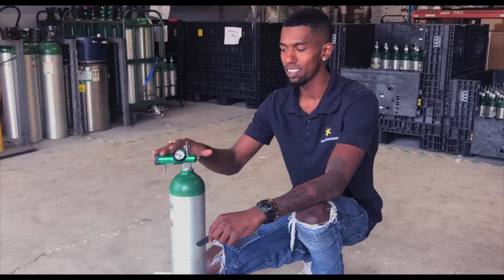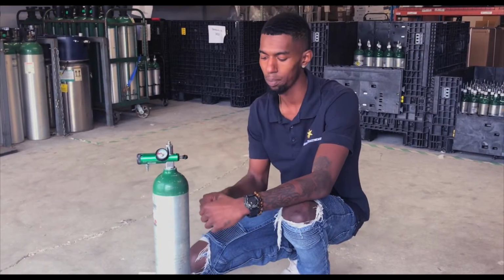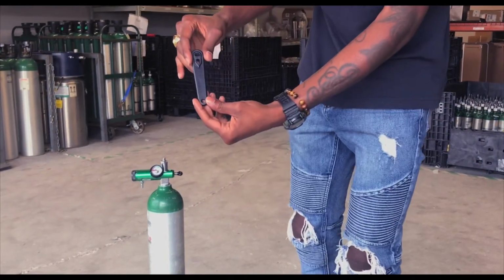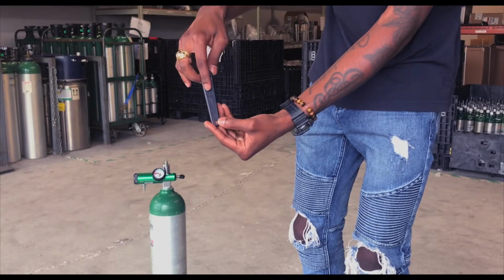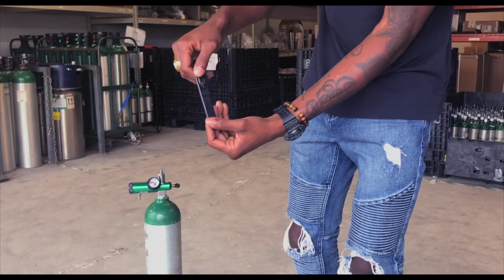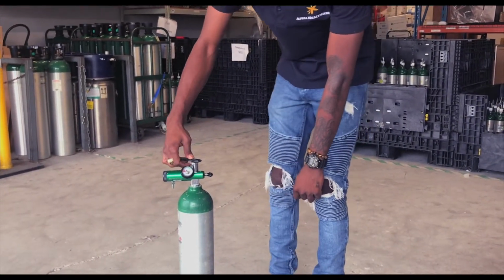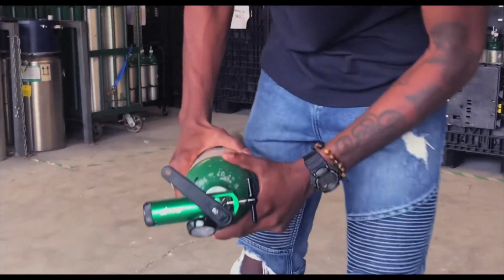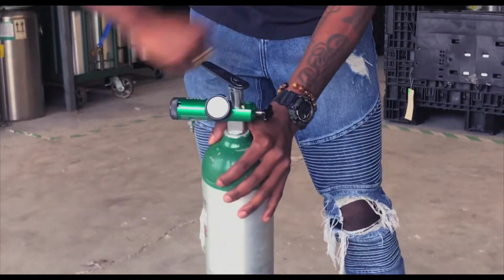Okay, now that you have your regulator on your E-tank, it's time to get some oxygen. But you need a key. So 9 times out of 10, your technician is going to leave you with a couple of black keys, and they have arrows on them indicating when the tank is open and when the tank is closed. Okay? So what I'm going to do is place my key on the top of my E-tank, just like so, and I can already tell that the arrow is pointing counterclockwise.